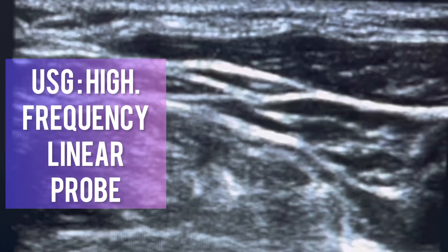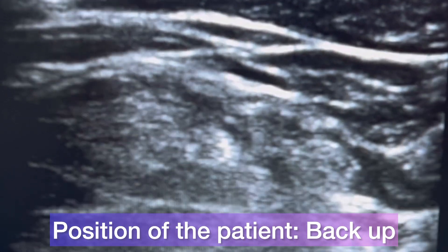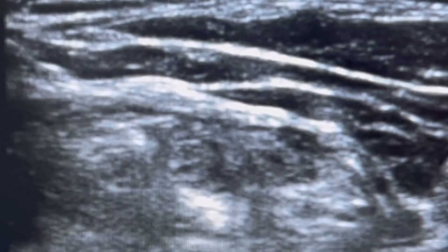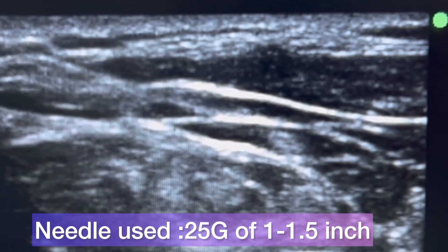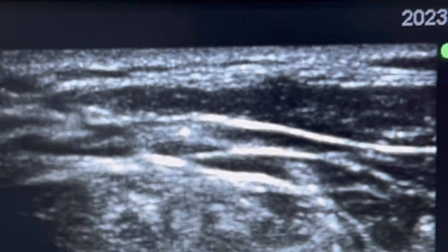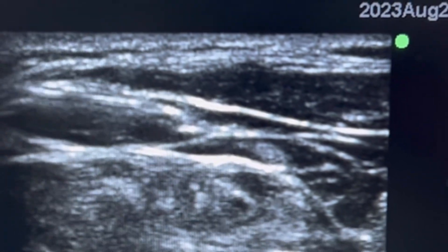The ultrasound probe used in this case is a high frequency linear probe. The patient can be in semi-sitting position or supine position with head turned towards the opposite side. The area over the neck can be prepared with chlorhexidine or iodine-based solution. The probe is placed over the posterior border of the sternocleidomastoid at its midpoint. A one and a half inch, 25 to 27 gauge needle can be used. The needle is inserted using an in-plane technique under the sternocleidomastoid muscle.